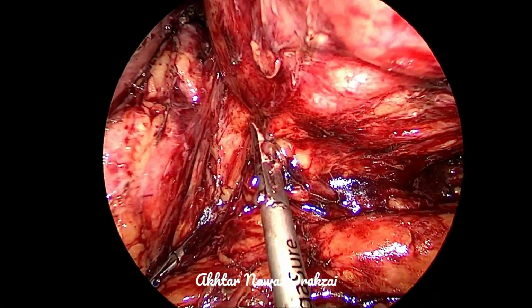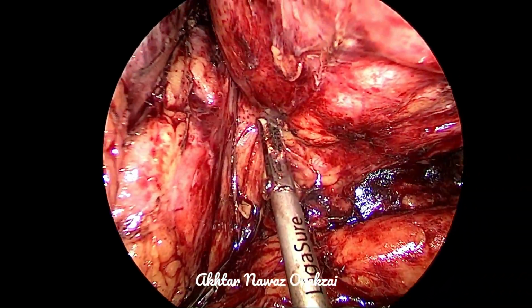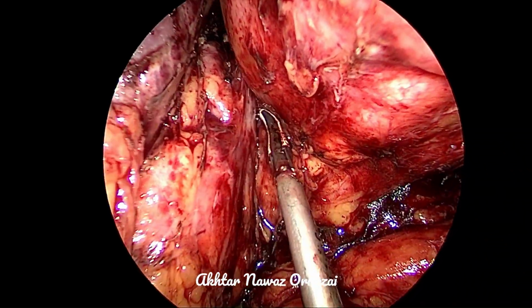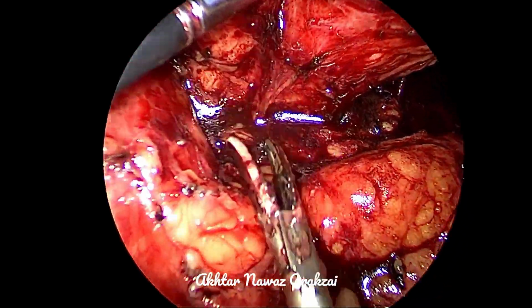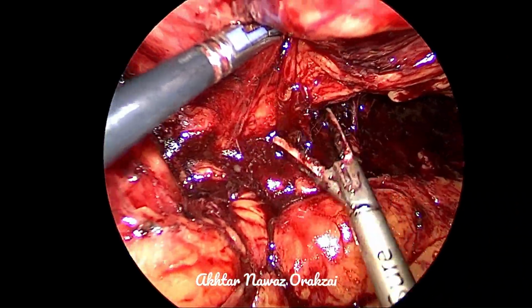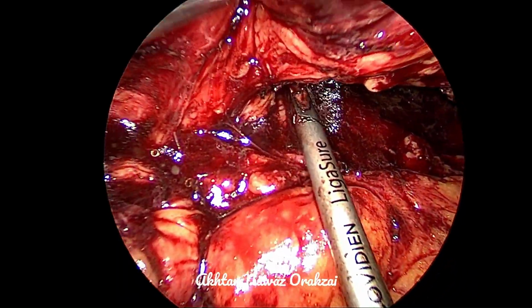And then we have progressed along the anterior surface of the kidney. And now we are concentrating on the hilum of the kidney. Although the structures are not very easily identifiable, we can see that the tail of the pancreas has been lifted up off the renal hilum. So we are now trying to identify the renal vein.